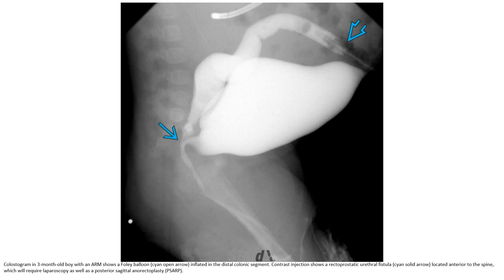Colostogram in a three-month-old boy with anorectal malformation: a Foley balloon inflated in the distal colonic segment with contrast injected. A rectal prostatic urethral fistula is located anterior to the spine, which will require laparoscopy as well as a posterior sagittal anorectal plasty.